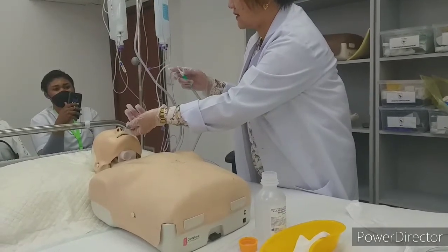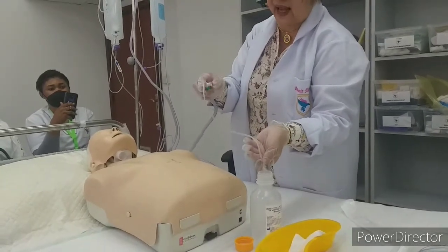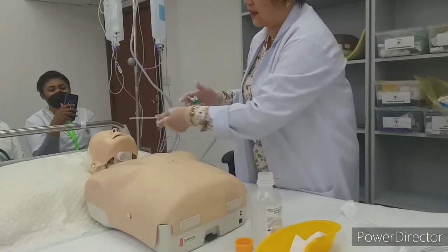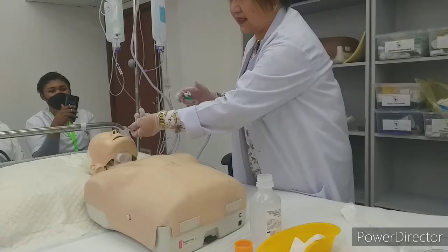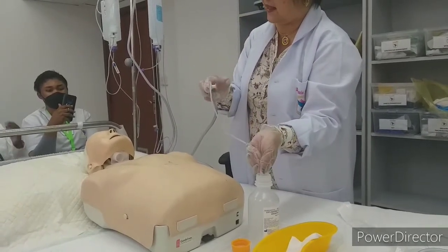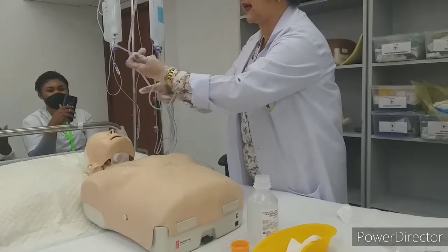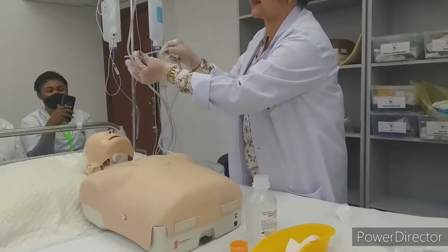So insert, suck, suck, suck. Go to the saline, suck in, suck in, suck in. Go to the mouth, suck in, clean it, dip, suck in to the nose. You can dip around 4 to 6 inches.